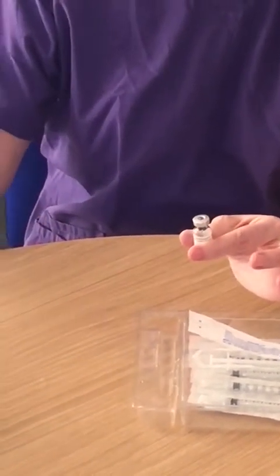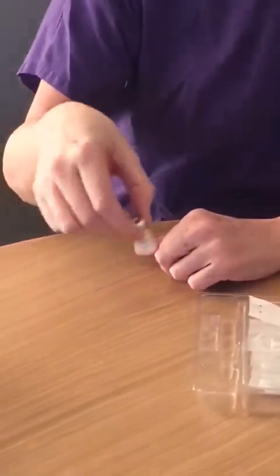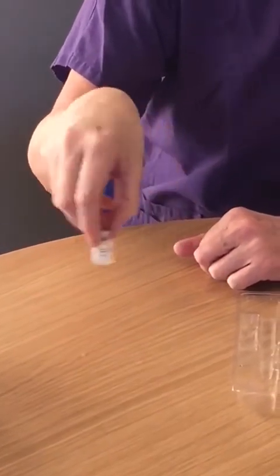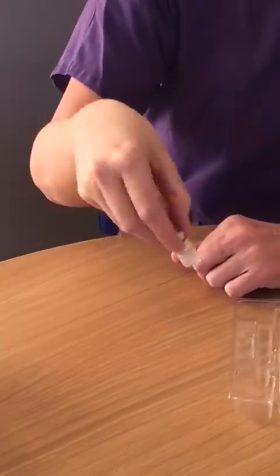Place the used syringe into your sharps bin. Gently swirl the vial so that the powder and the liquid dissolve. This should happen quite quickly.